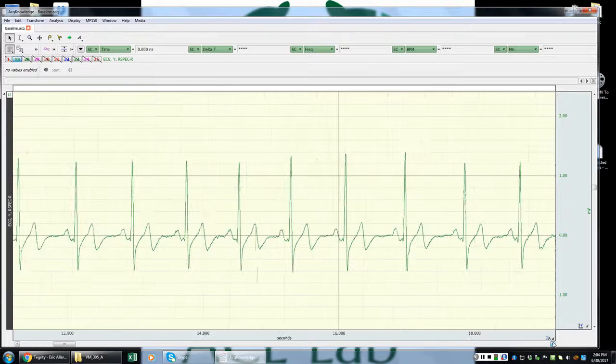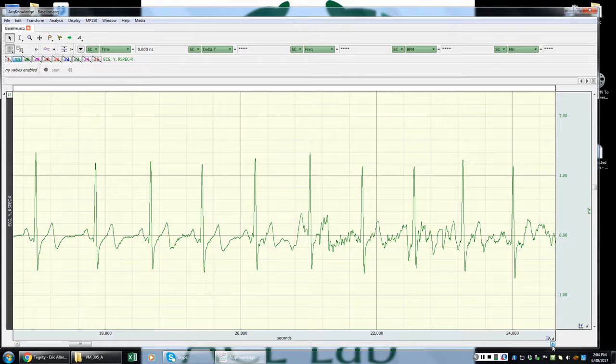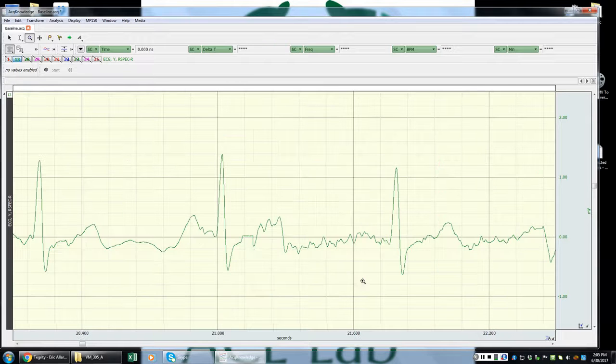But as we scroll down a little bit, you're starting to see that there's a little bit of erratic patterns in the ECG complex. Now, even though you see that some of these patterns in between the R peaks look a little oscillating, as long as these R peaks are still present and accounted for, you don't have to really worry about the nature of this signal. So for instance, if I zoom in here, you see that there's this little kind of drop off in signal right here.